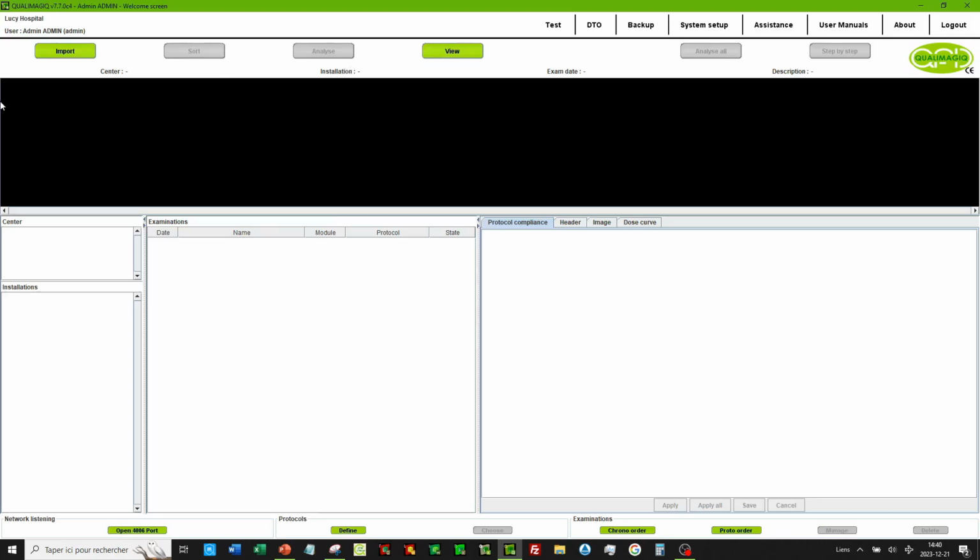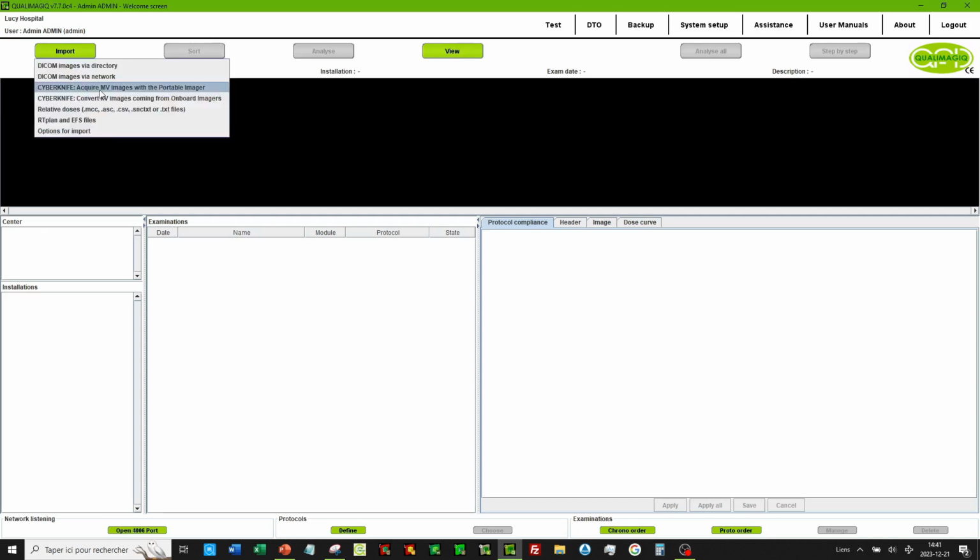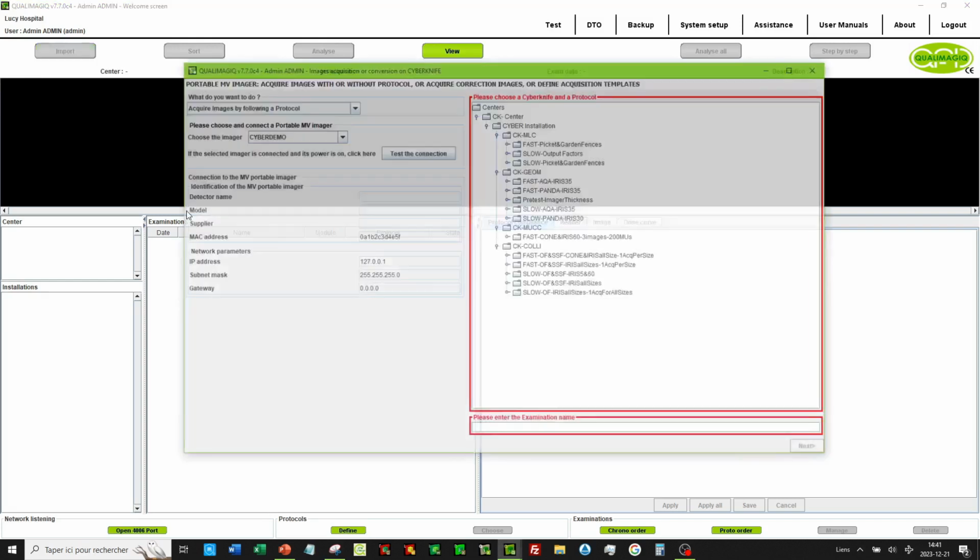I have already launched QUALIMAGIQ. Please refer to our full video linked below on how to connect to this platform. Once connected, you will go to the import menu and select the corresponding option, which will show you how we drive acquisition with our portable high-energy imager.